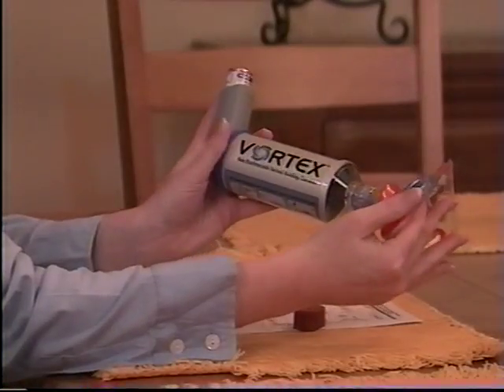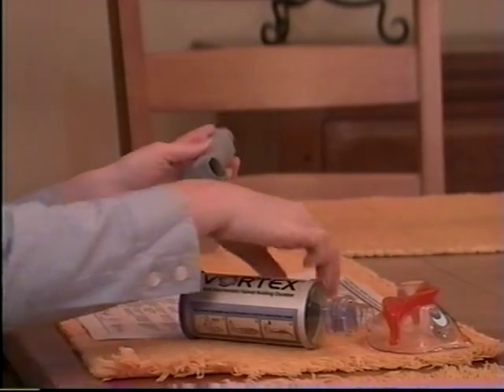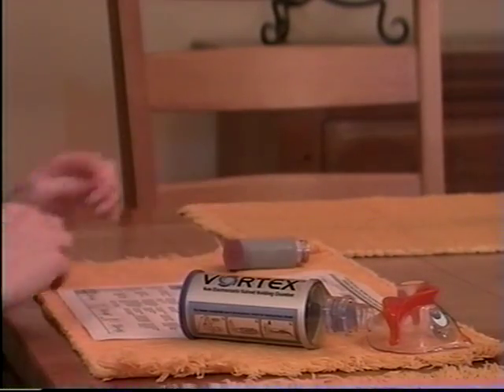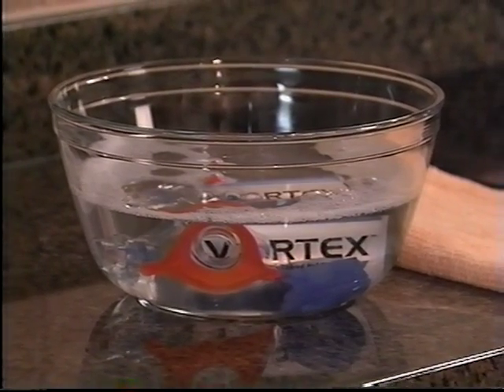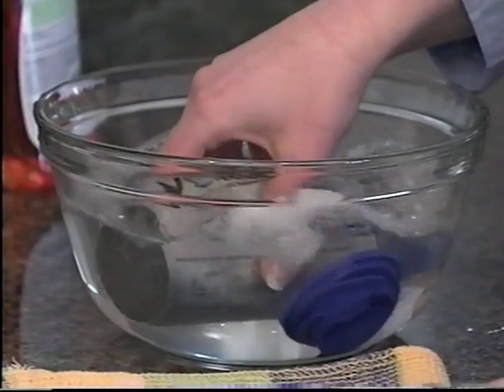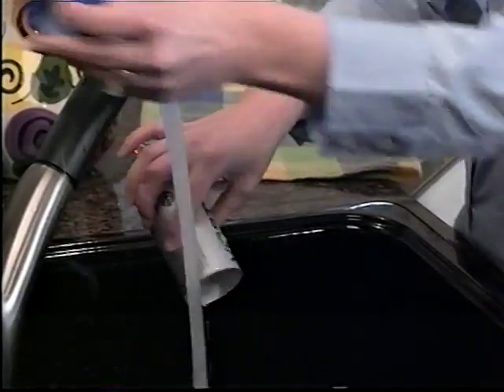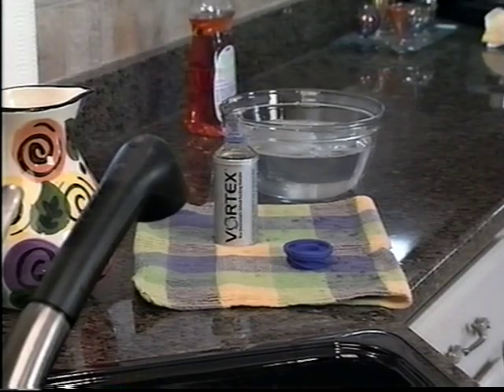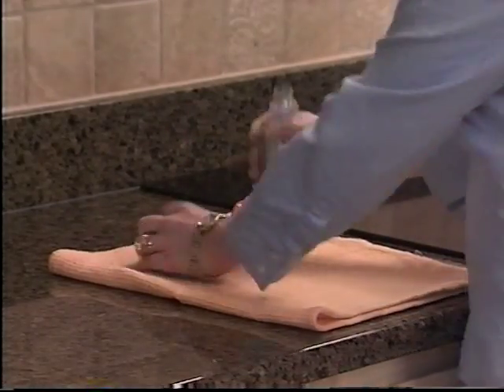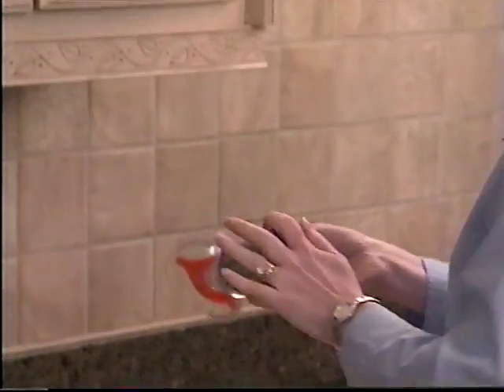To clean by hand, start by removing the inhaler and receptacle, and if a mask is used, remove it as well. Second, soak parts for 15 minutes in warm water with liquid detergent. Agitate gently by hand. Then, rinse it in clean water and shake it out in the sink. Air dry the VORTEX in a vertical position on a clean, lint-free cloth. Finally, when the VORTEX is completely dry, reassemble the parts and it's ready for use.